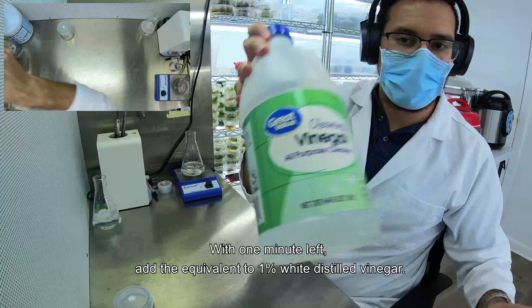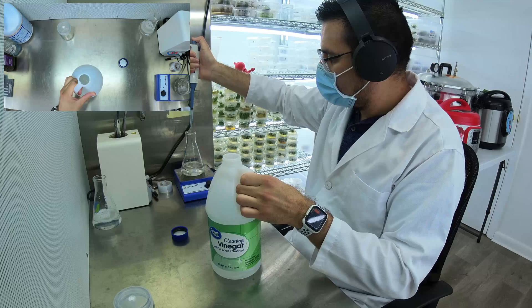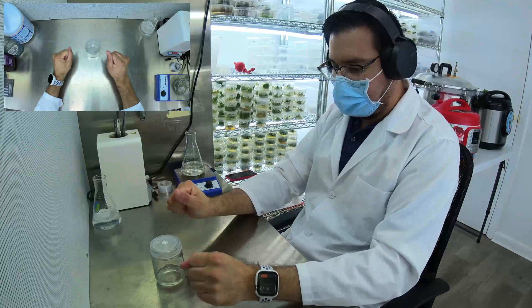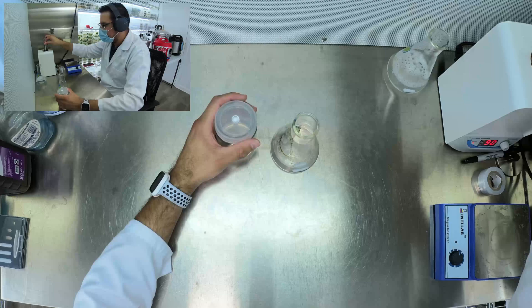With 1 minute left, add the equivalent of 1% white sterile vinegar. I have 100ml of hydrogen peroxide so I will use 1ml of vinegar.